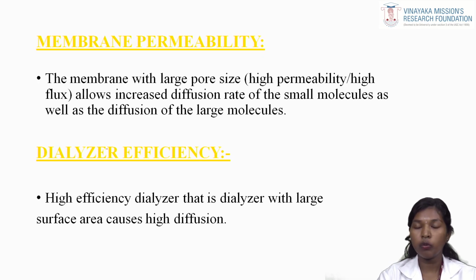In those pores, the movement of solute, small molecules can move easily, medium size molecules can also move easily, and at the same time large size molecules can also move easily. So membrane permeability is a very important thing in diffusion, one of the important factors which affect the diffusion.